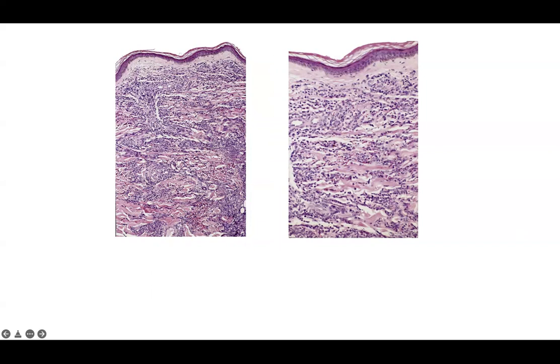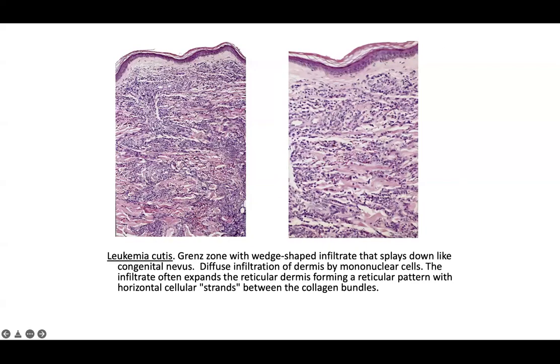This next case has a similar interstitial growth pattern. However, the cells are small and hard to characterize on high power. Importantly, there is uninvolvement of the superficial dermis. With a neoplastic lymphoid population, you'll often have uninvolvement of that top layer — a grenz zone — and a wedge-shaped infiltrate that splays down, somewhat like a congenital nevus. This is leukemia cutis.